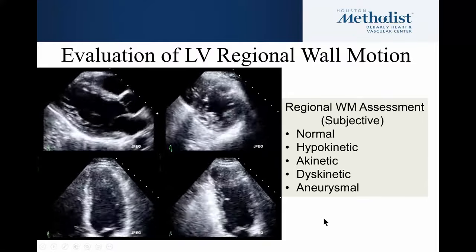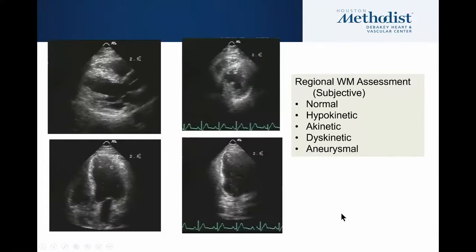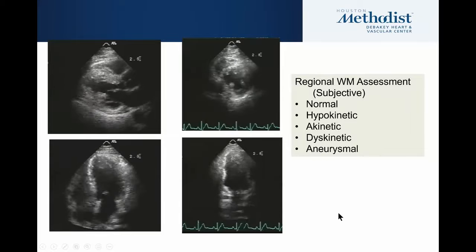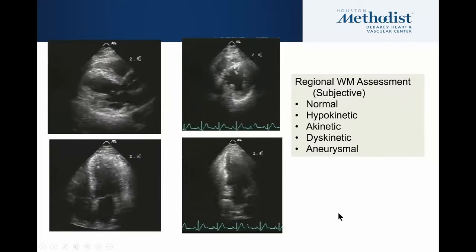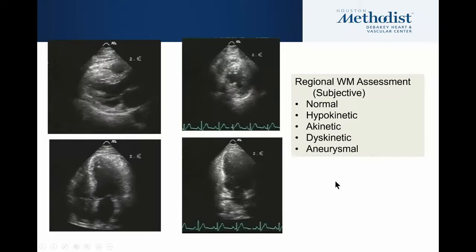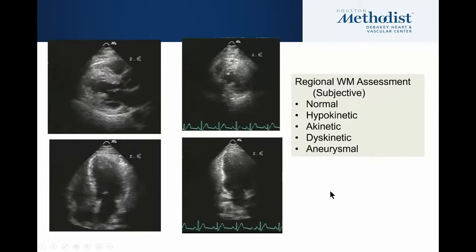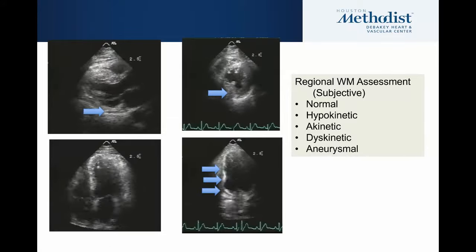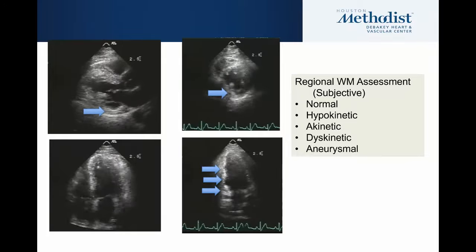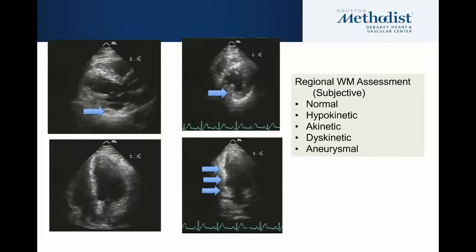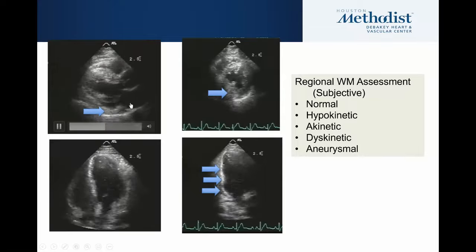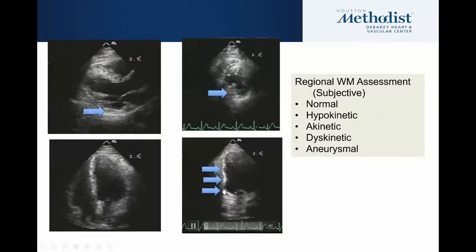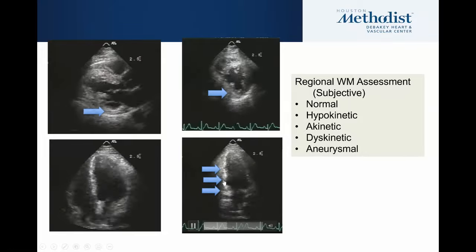This example is a nice normal example. Now here we have a patient that does have some abnormalities. Using the same system, I'm going to help you with the arrows. The areas pointed by the arrow are areas that are either hypokinetic — for example, there's still some thickening here — or akinetic, or maybe even a touch dyskinetic. We could argue about whether this is a little dyskinetic or just akinetic.